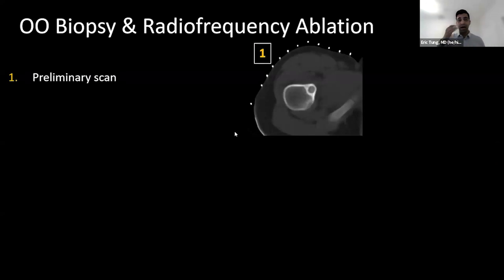Now, when we treat these, the gold standard non-operative treatment is radiofrequency ablation. And so these are the steps that we'll go through typically for a CT-guided radiofrequency ablation.